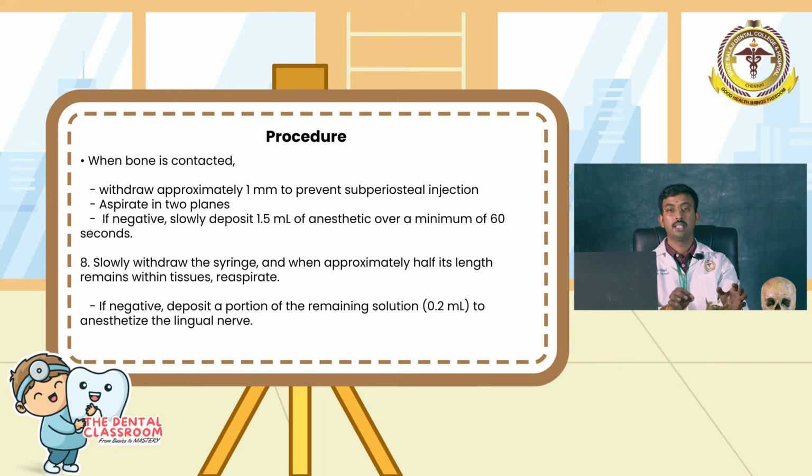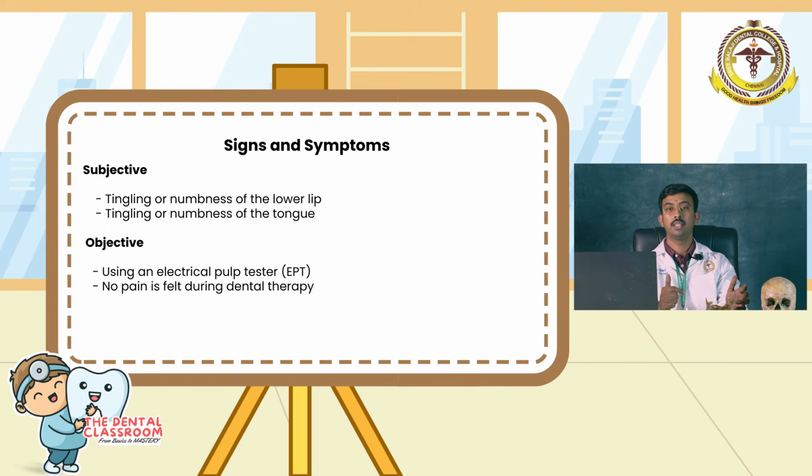So, after depositing, withdraw the needle and recap it carefully and wait for at least 3 to 5 minutes for the solution to act around the nerve bundle. Next, we have to evaluate subjective symptoms and objective signs.